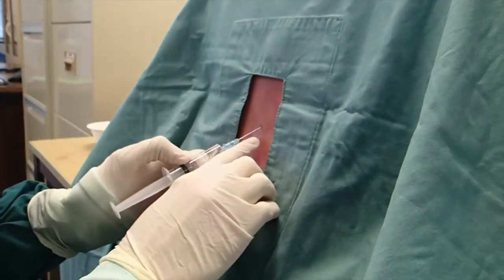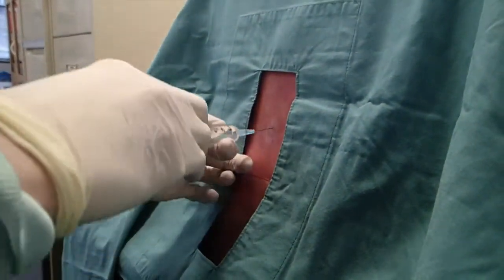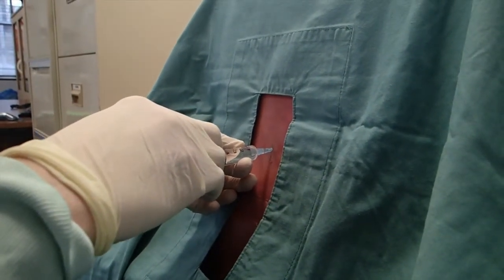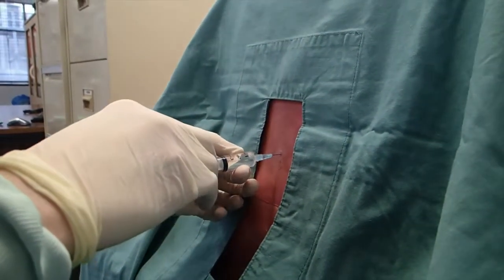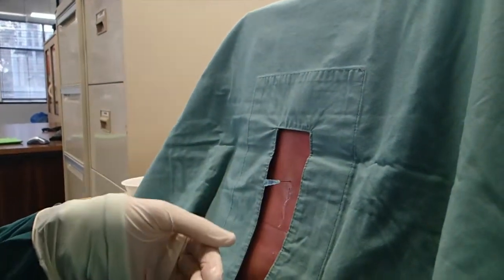So I'm going to inject local where the spot between the spinous processes was. And as I inject, I'm feeling where I'm going, so that's hard. So I need to go beneath that, injecting local subcutaneous tissue. Now it feels like I'm in the ligaments. And I'm injecting and numbing all of that skin. Feels like I'm in the right spot, so I'll leave the needle in to remind myself where to go.